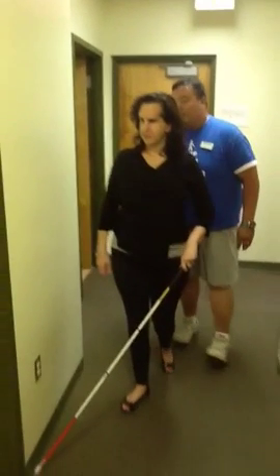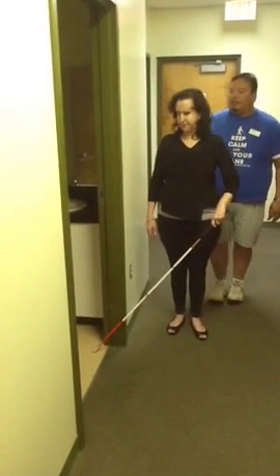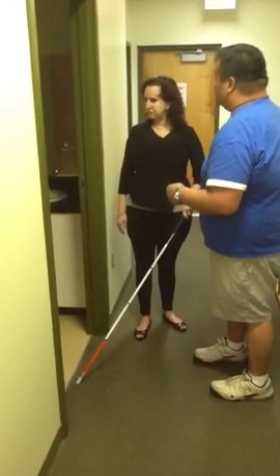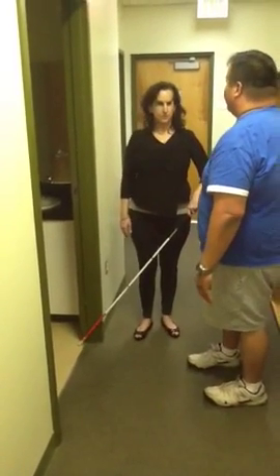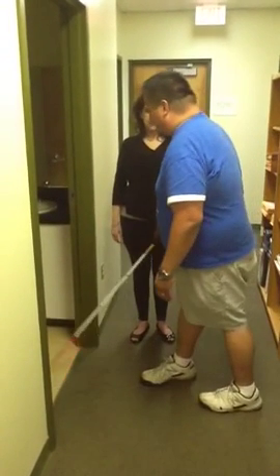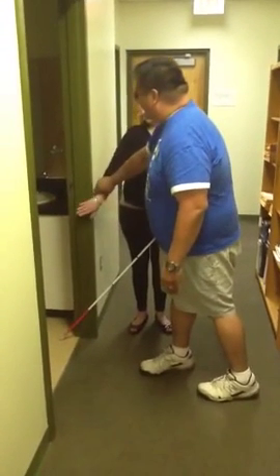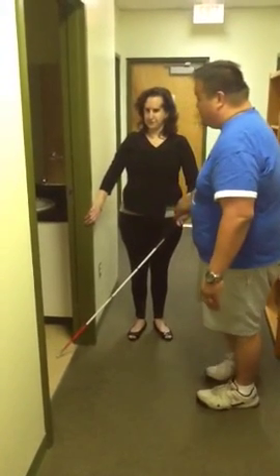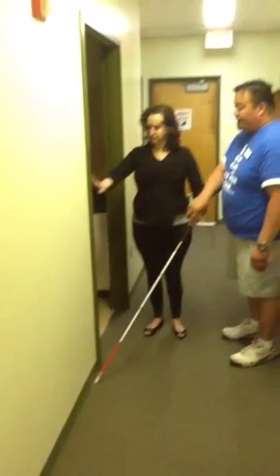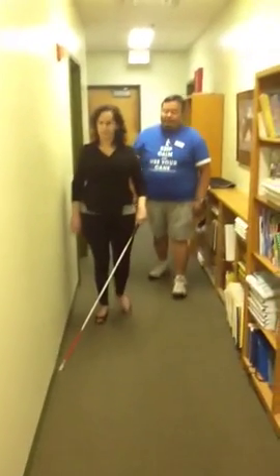Okay. So what did you just come up to? A doorway. Now, if it was dark in here, and you didn't really know the length of the doorway, you need to orientate yourself to where the doorway is once you leave it, because there's nothing to give you a reference. So you're going to take your hand and place it right on the doorway. Then you're going to keep moving till you find the other side, find it around, keep going. Yep, just like that. And just keep traveling on there.